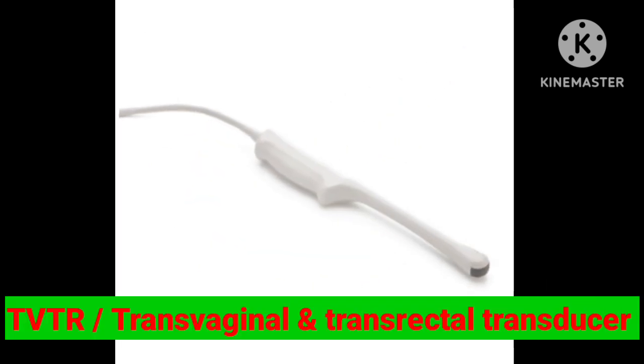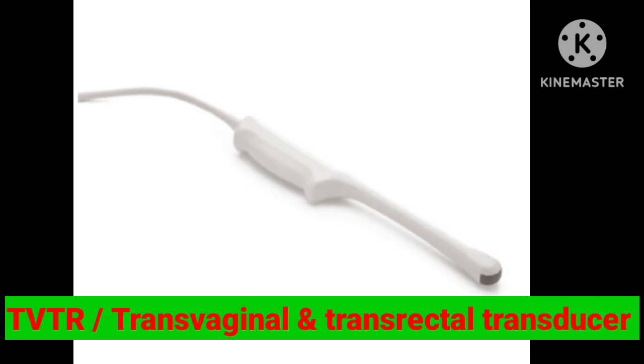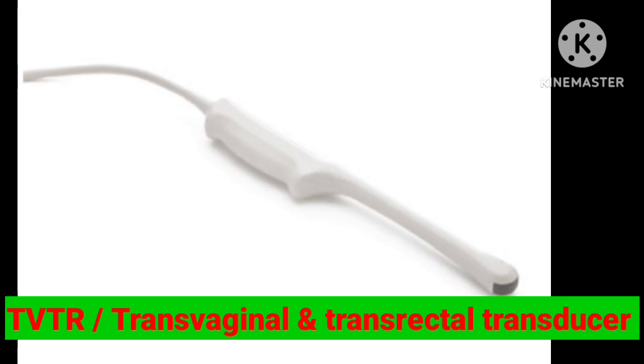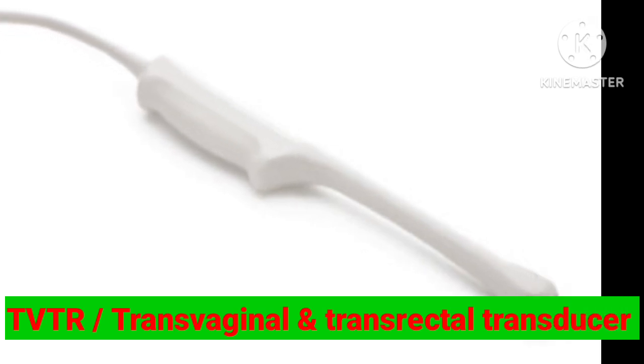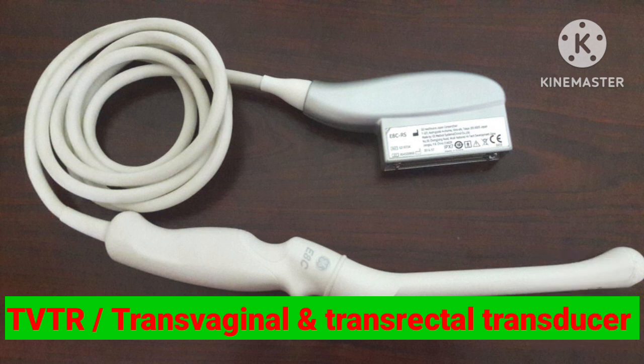This slide showing a transvaginal and transrectal transducer. It is otherwise called an endocavitary probe. It uses the frequency between 5 to 11 MHz. It uses higher frequency, that's why it has low penetration. It is otherwise called a TVTR transducer.